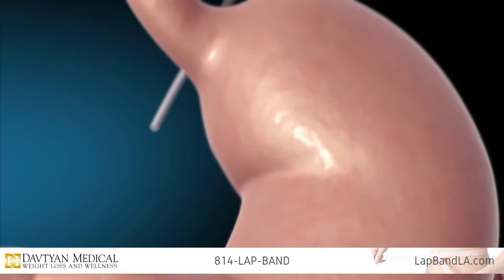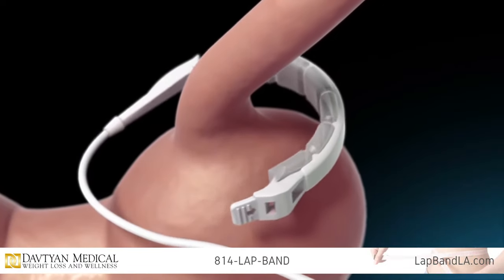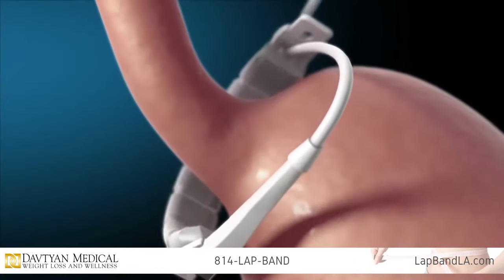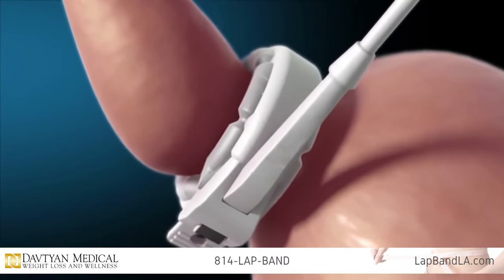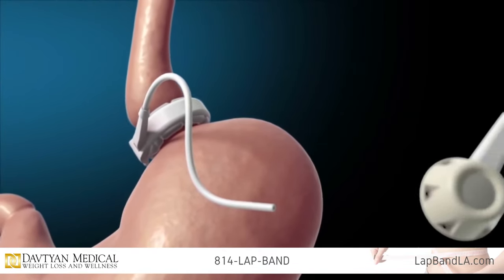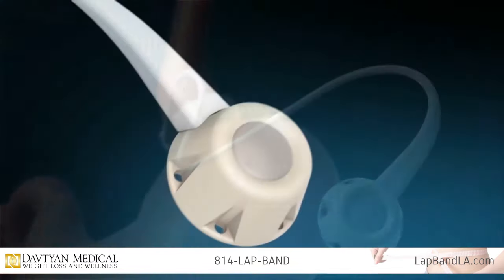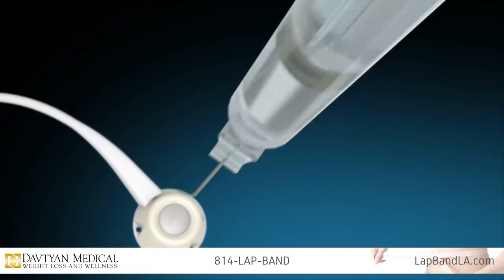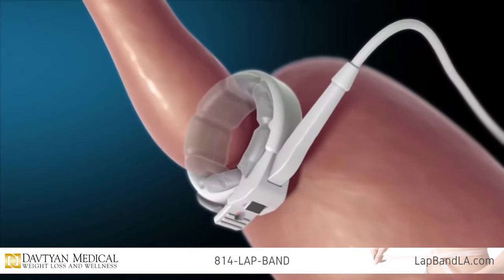During a minimally invasive procedure, an adjustable band is placed around the upper part of the stomach, creating a small pouch. The band is connected by thin tubing to an access port below the skin. Through this port, your surgeon adjusts the lap band by inflating or deflating the inner balloon with saline.